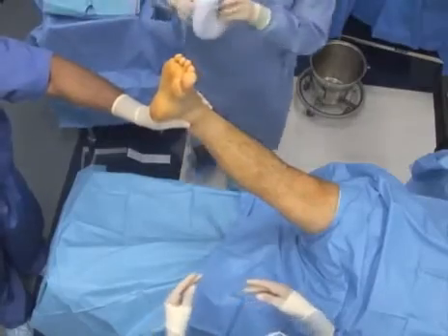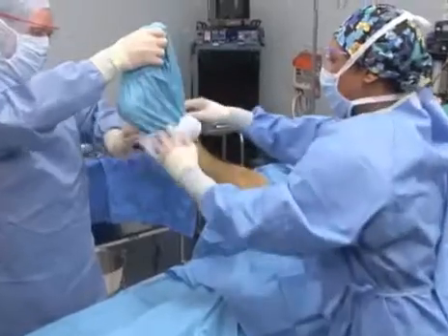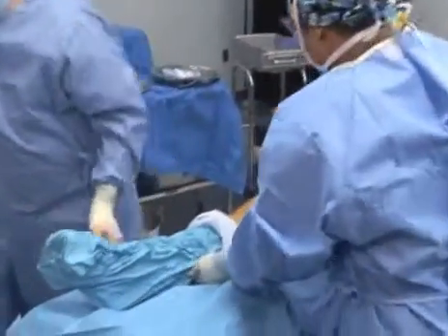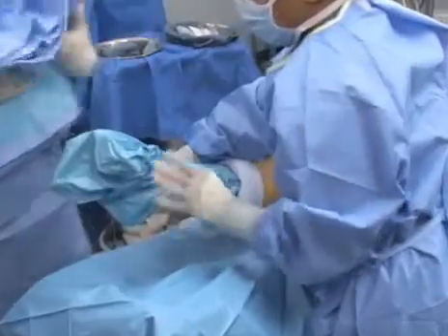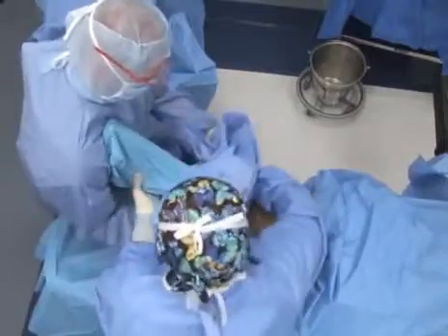When draping the leg, the foot is excluded from the surgical site by wrapping it with a tube drape or tube stockinette. The limb must be held up and away from the operating table while the stockinette is applied. Rolled stockinette is placed over the foot or hand and unrolled to cover the limb. A fenestrated drape is used to complete the surgical field.